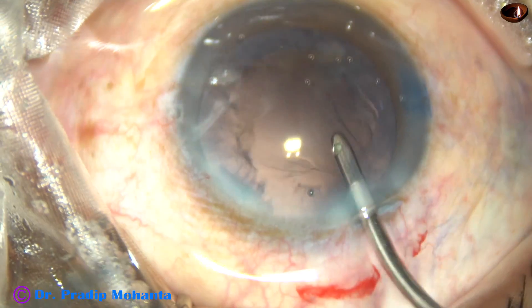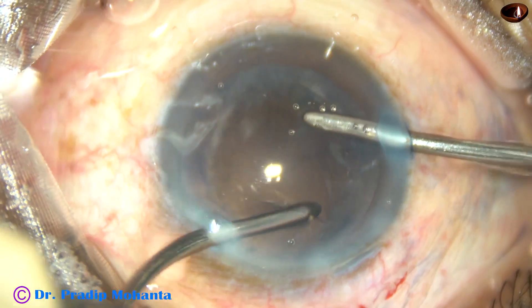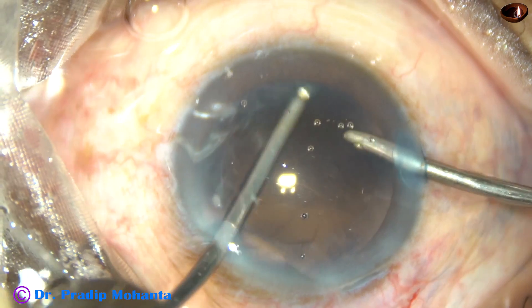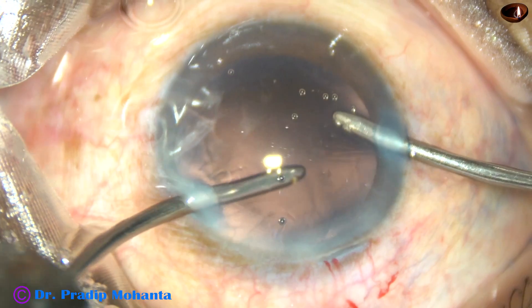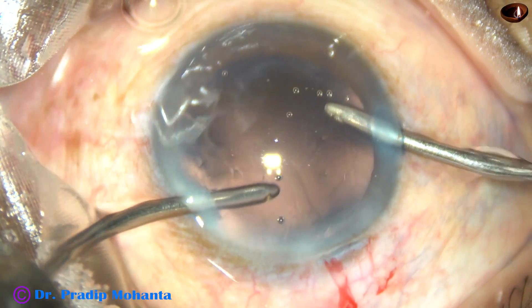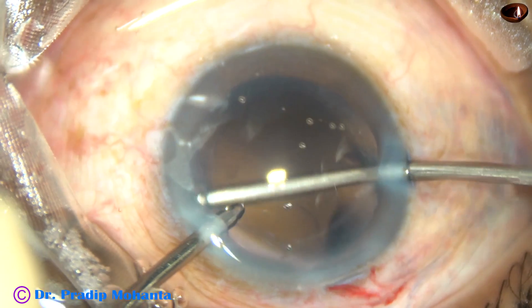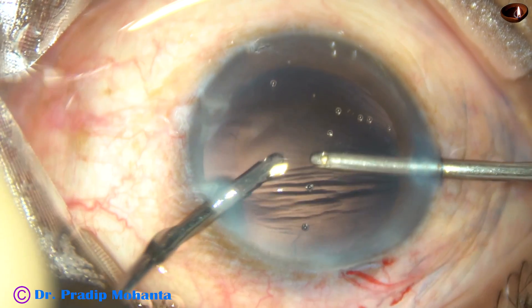Now you are going to use bimanual irrigation-aspiration for cortical clean-up. It is very easy and it looks elegant. At this time irrigation is from the right side and aspiration from the left, and most of the cortical matter has been removed by this time. Now I change hands — irrigation from the left, aspiration from the right — and here it is: the cortex is cleaned.